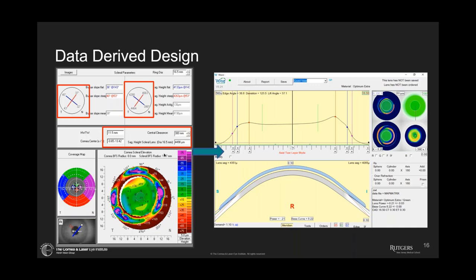When I look at this data, it totally tells me why everything wasn't working well. Currently I actually wear a ScanFit lens on this eye. I don't have any irregularity but I do have very dry eyes, and in high-wind environments — biking or kayaking — I want something covering my eyes. This is helping to derive the lenses, and I can use this not just for an empirically driven lens but to understand how I might design a quadrant-specific lens. On one meridian from nasal to temporal, I want to go ahead and create a tighter temporal side and a tighter inferior side to get this lens to center well on me so I don't have lens awareness.